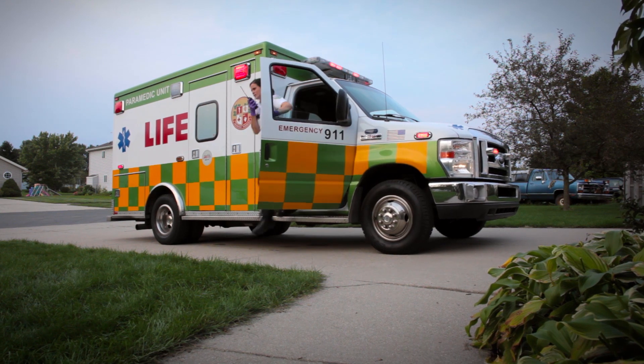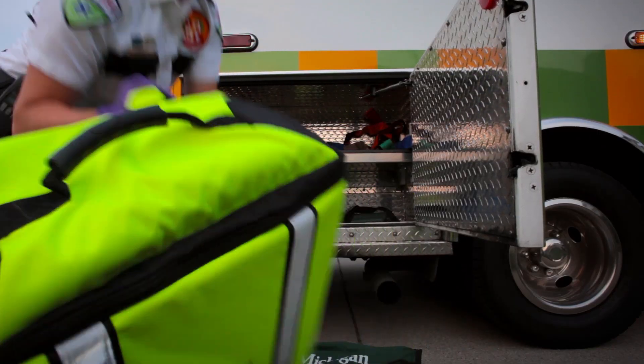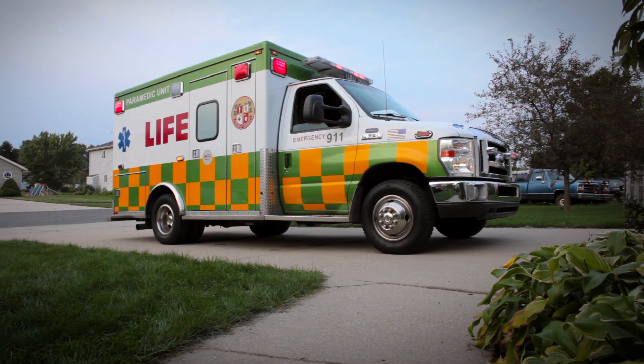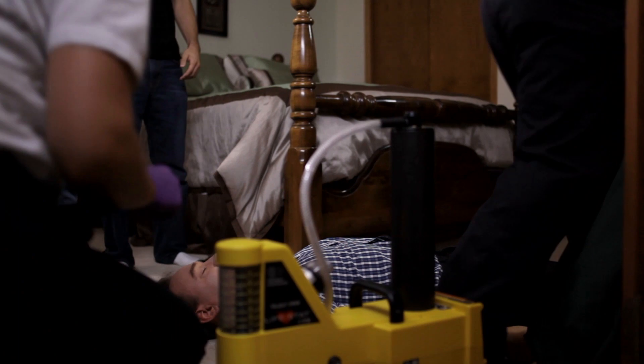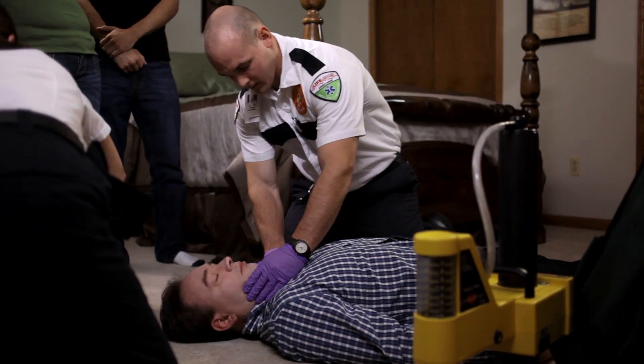Sudden cardiac arrest accounts for approximately 325,000 deaths in the United States each year. If CPR is not administered quickly after cardiac arrest, the victim's chances of survival are reduced by 7 to 10 percent with each passing minute.